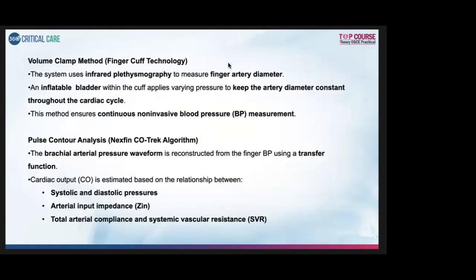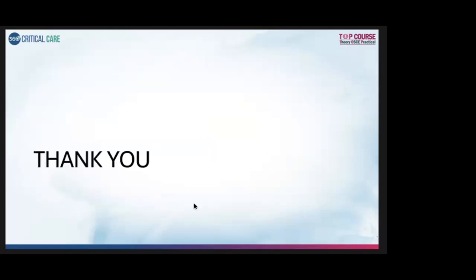And along with this volume clamp method, there is the pulse contour analysis which keeps happening, where the brachial arterial pressure waveform is reconstructed from the finger BP using a transfer function, and then cardiac output is monitored using a non-invasive technique. So this completes our cardiac output monitoring.